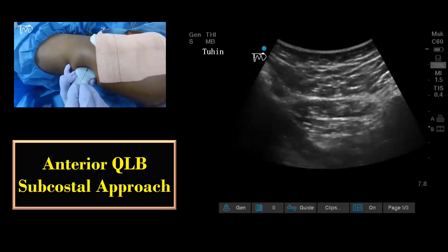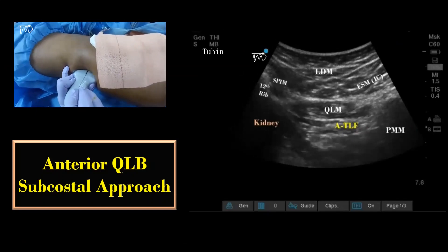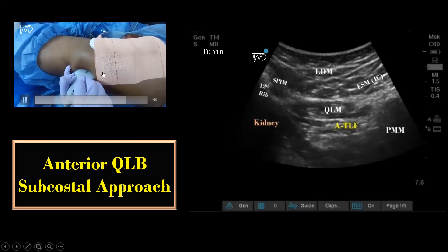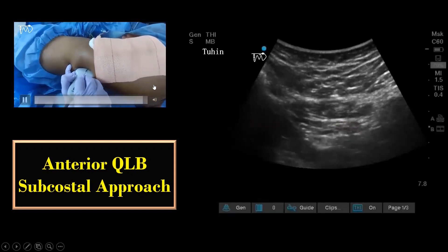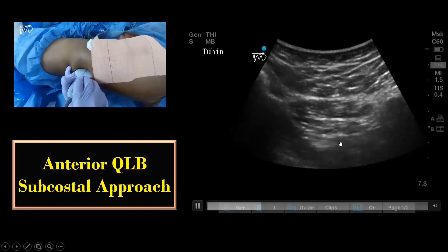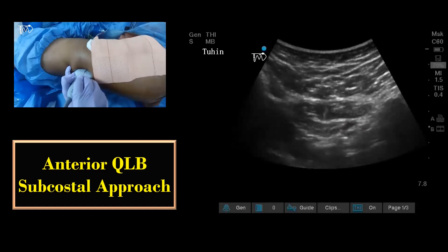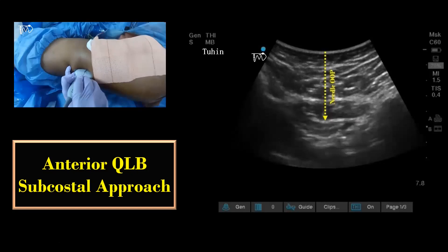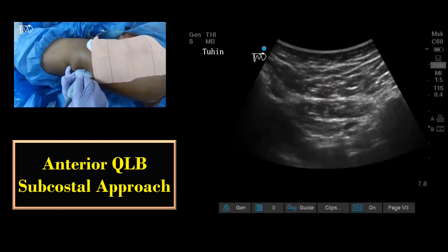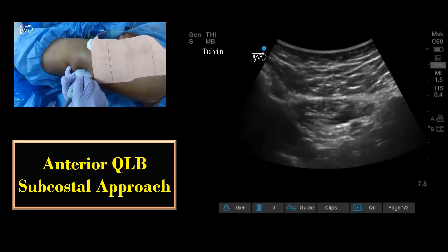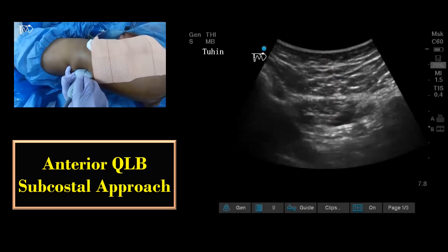I prefer the out-of-plane technique for this block, but you can also use the in-plane approach from caudal to cranial needling. Once the needle tip is positioned between the epimysium of the QL muscle and the anterior layer of thoracolumbar fascia, the local anesthetic is injected in 3 to 5 ml aliquots after negative aspiration for blood.